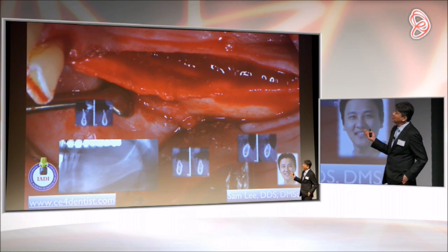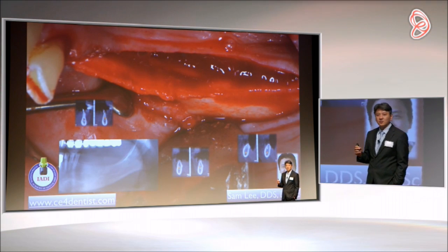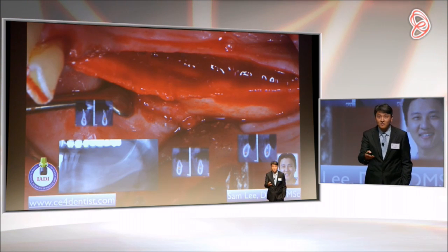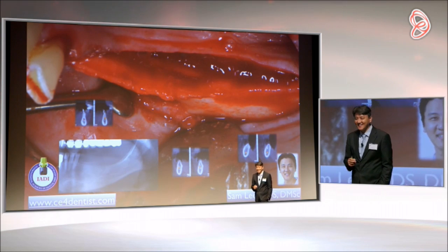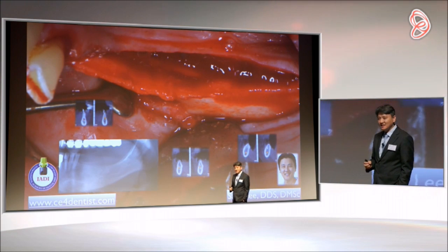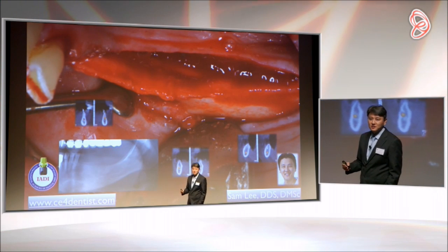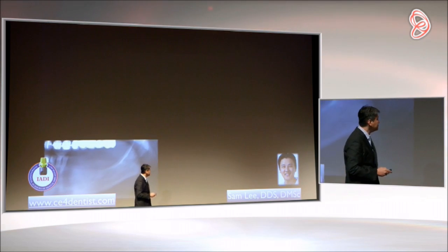So as you can see, many patients will come to your office without any bone. Usually, they have money, but they have no bone. Or they have bone or no money, correct? So this patient presented with money, but no bone. Now we have to do some surgical procedure in order to add bone to our patient.